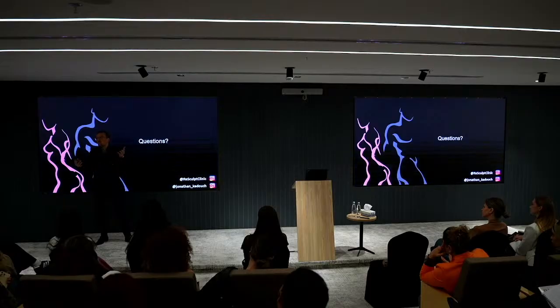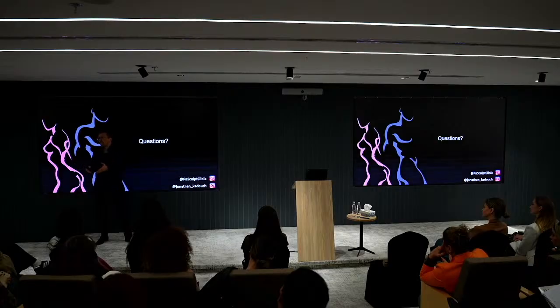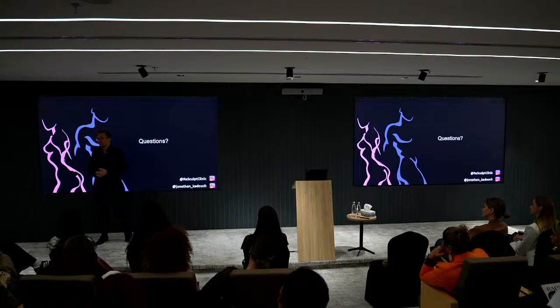I don't need to go 1 cc. If I open a 1 cc, I will find something else to inject as well. But if it's just a teardrop, the contour will be enough. So that's the way I use it, and in practice, it works very well.